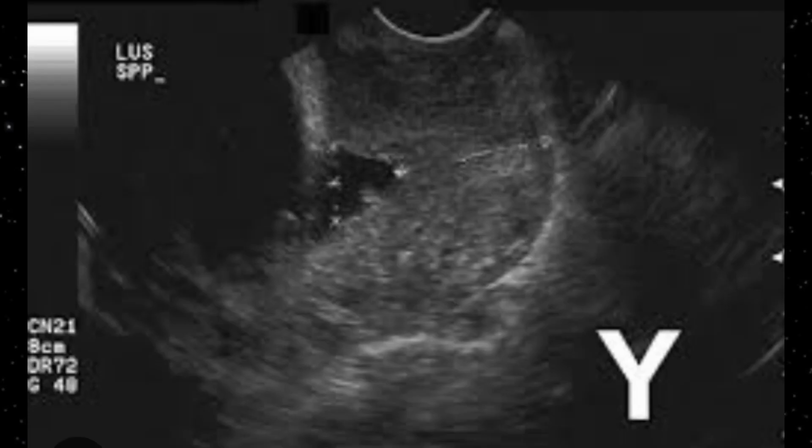This is a transvaginal scan, and on this transvaginal scan you can appreciate the amniotic fluid, because this was a gravid uterus. You can also appreciate that the internal os is dilated. It is more than 4 millimeter. The 4 millimeter is the normal criterion for the internal os, but it seems that it is more than 4. It may likely be 6 or 7. The cursor has already been indicated here. In that case, cervical length was normal, cervical width was normal, the external os was clear, and there was no dilatation of the external os.